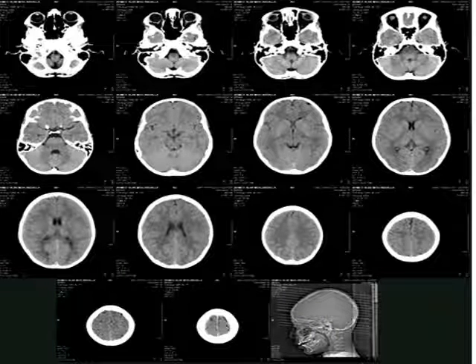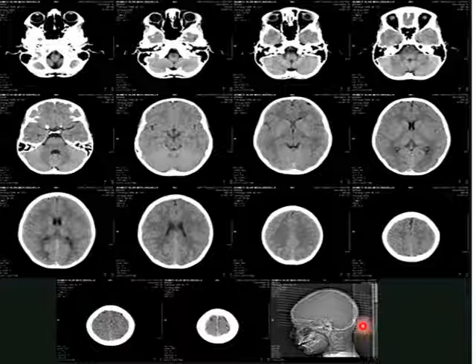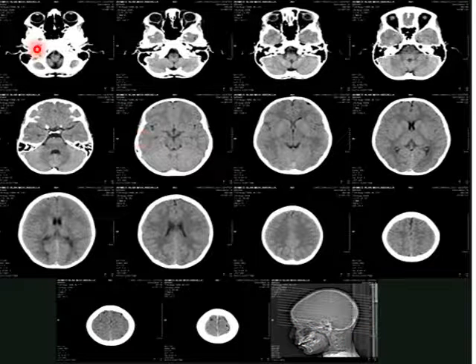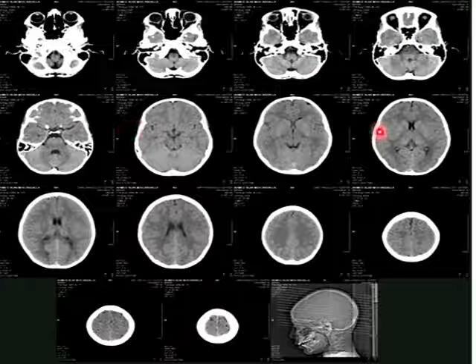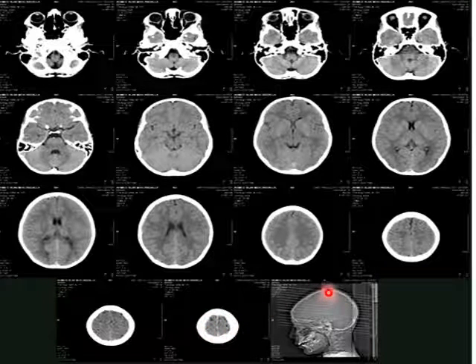And this slide shows the film of a normal CT scan. This is the scanogram, starting from the baseline like here and then advancing proximally. The first cut here in the base of the skull is this plane. So starting from here, it advances upward like this till reaching the high parietal lobe or the vault of the skull here.